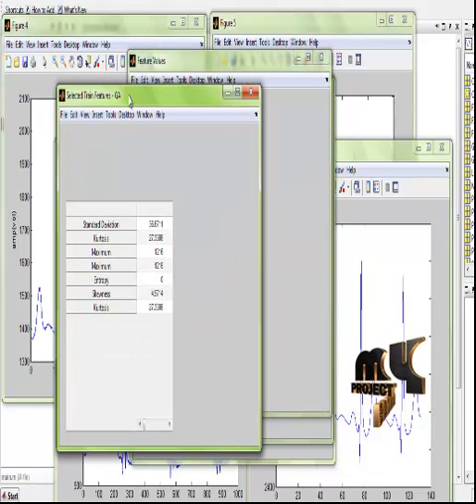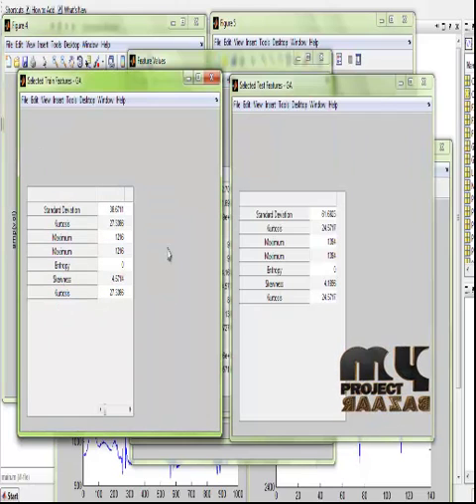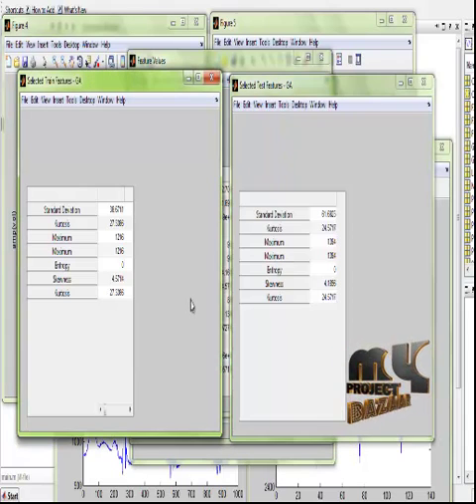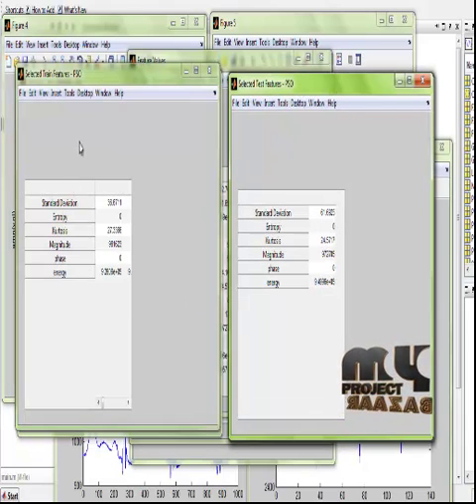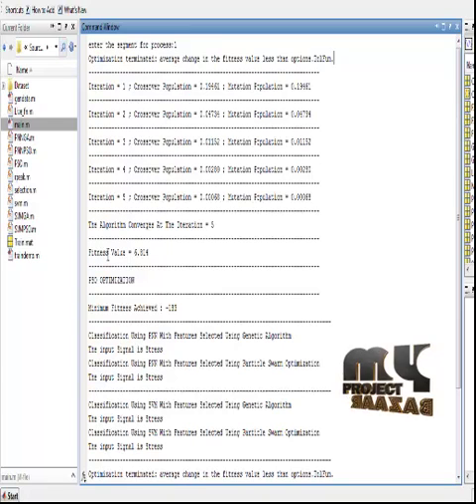So this is the features selected using genetic algorithm. After this is the selected train feature and the test feature using genetic algorithm. This is the selected train feature and the test feature using particle swarm optimization process. For genetic algorithm, this is the number of iterations taken, the population, and the final fitness value estimated. And for PSO optimization, this is the minimal fitness achieved.